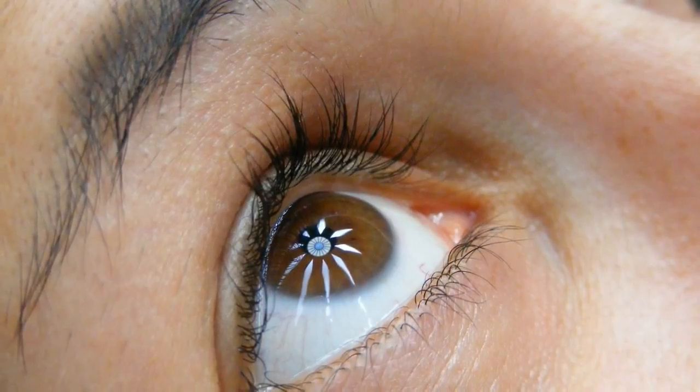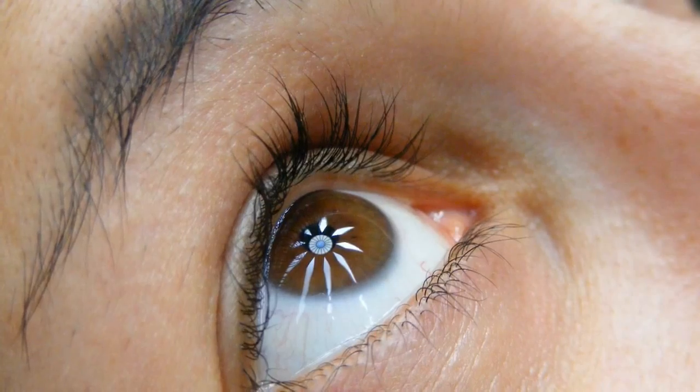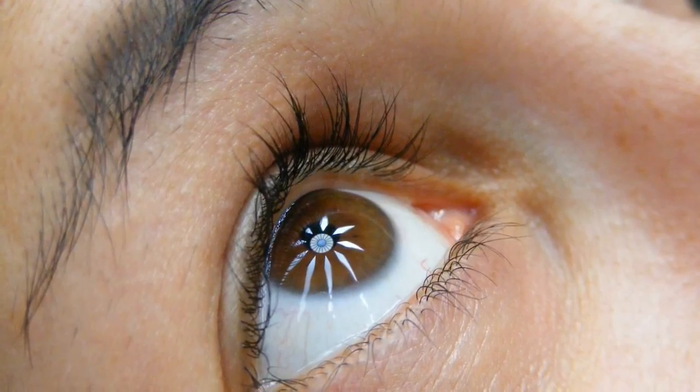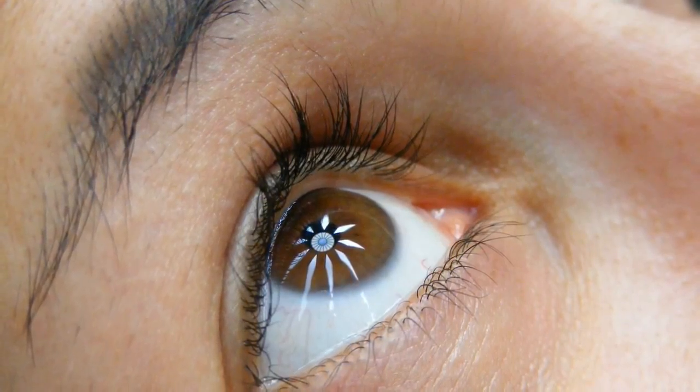Previously, implants corrected this problem by redirecting light rays to another part of the macula, but restoring the center of vision came at the expense of peripheral vision.